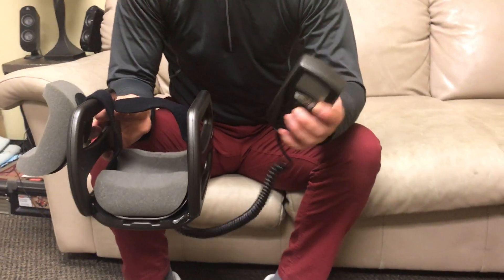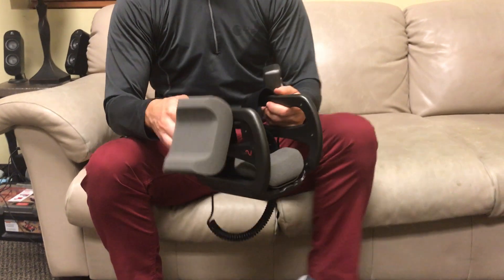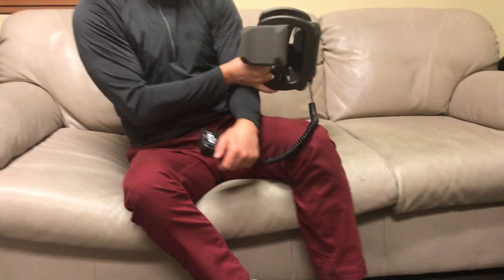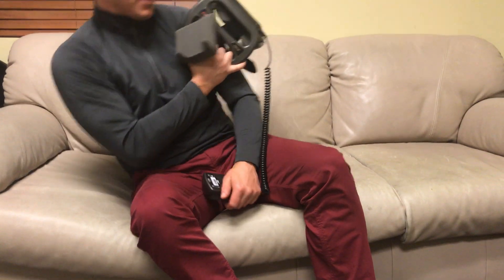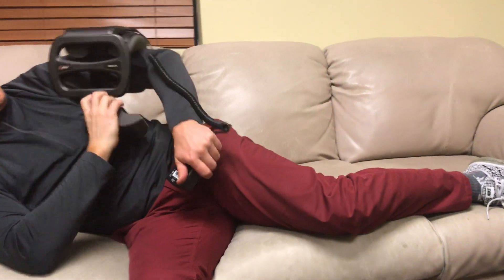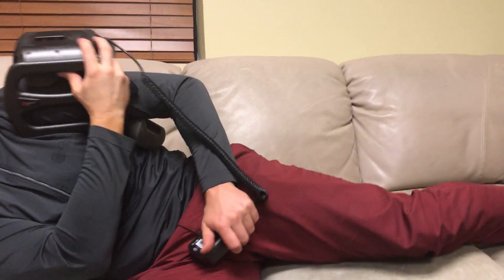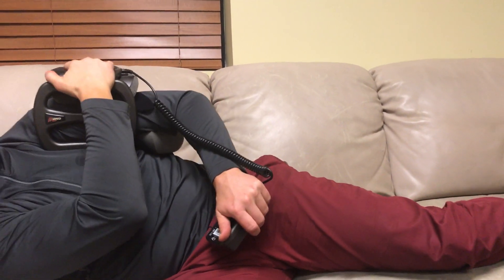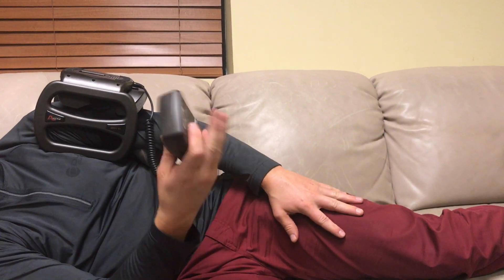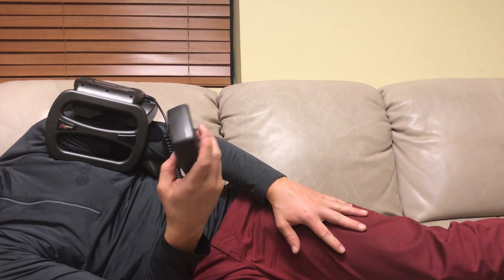To utilize it, get it in place first. For the proximal humerus, you're going to lay down. I'll act as if the left humerus is what we're treating — wrap it under, get it around the fracture site, then just lay down, watch TV, read a book, whatever it is — get comfortable.